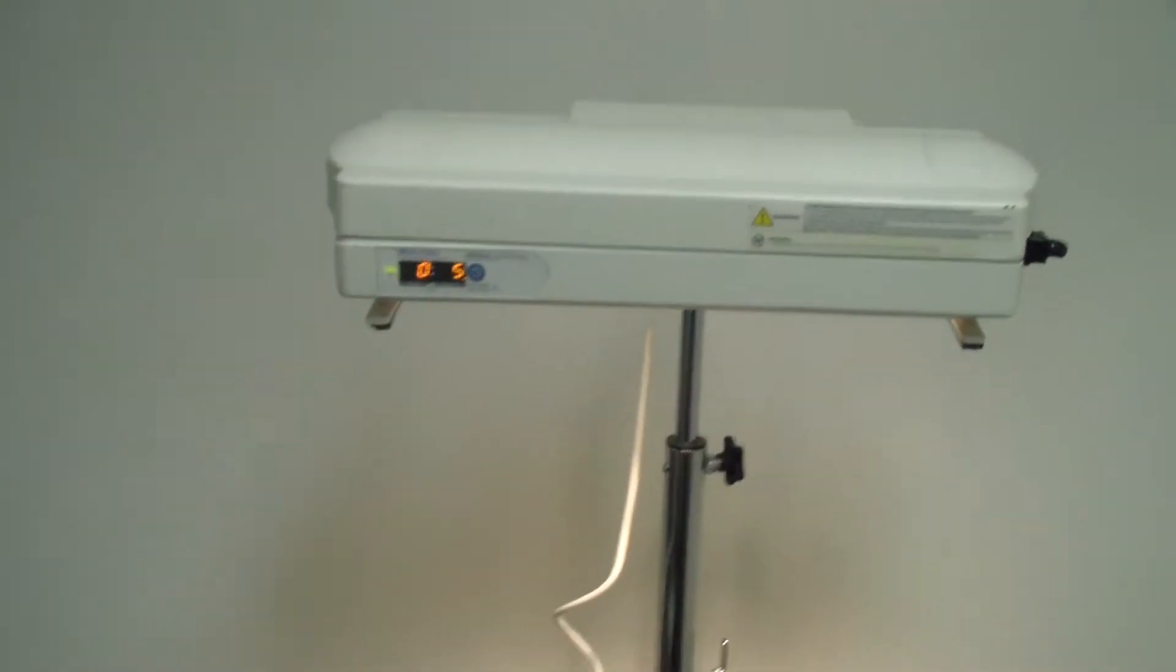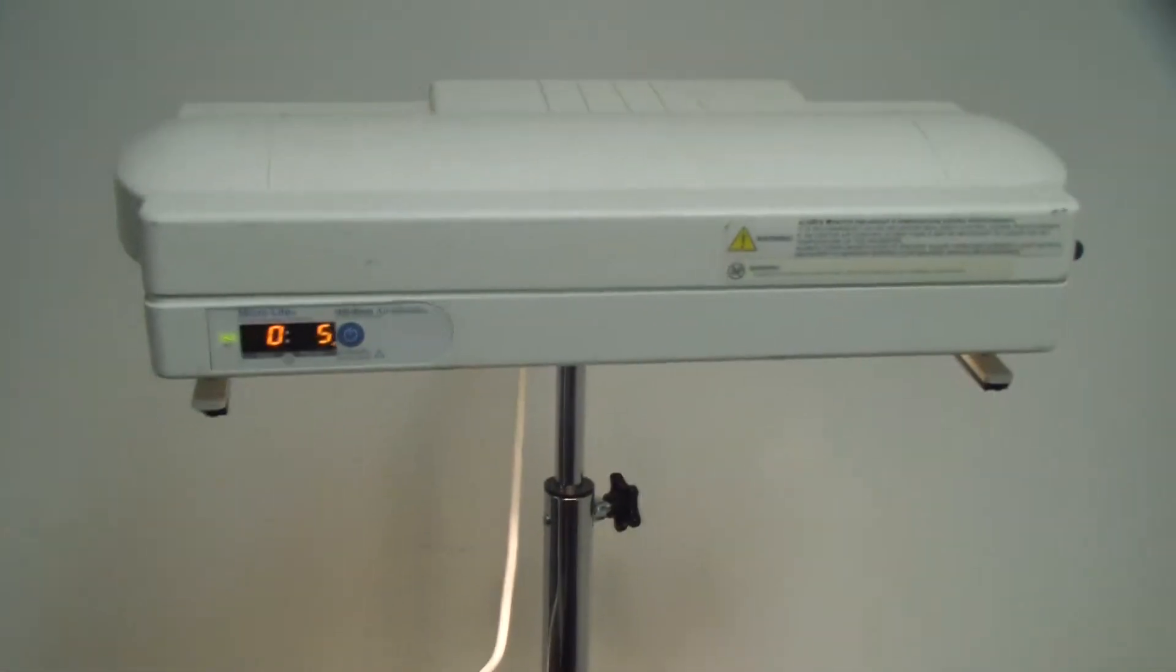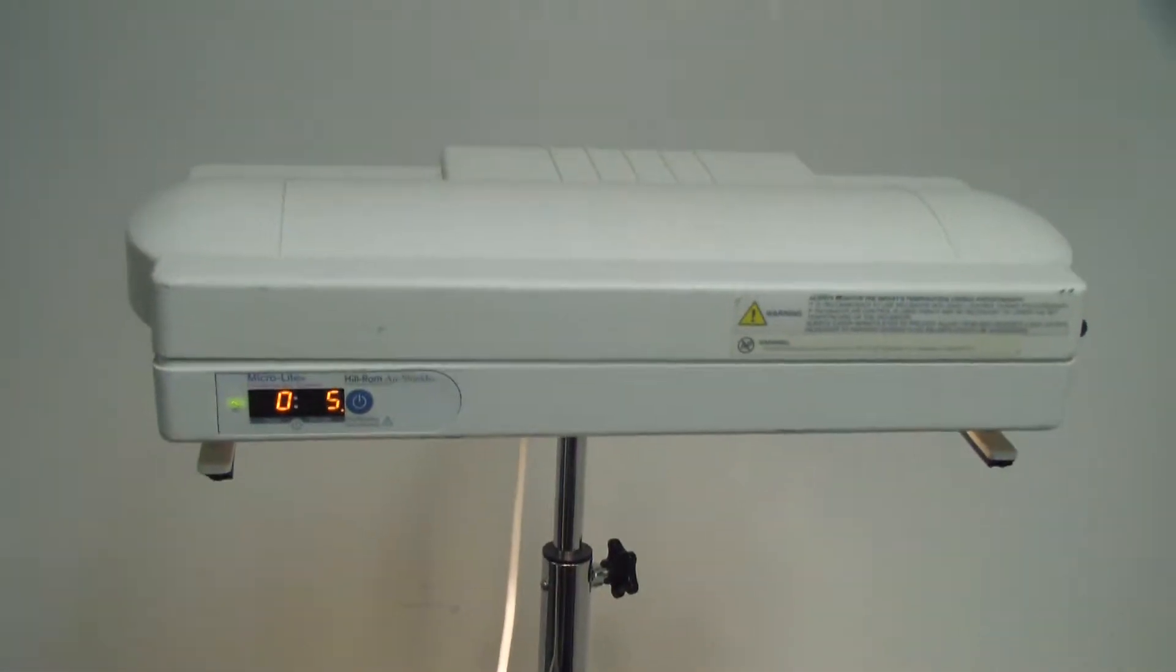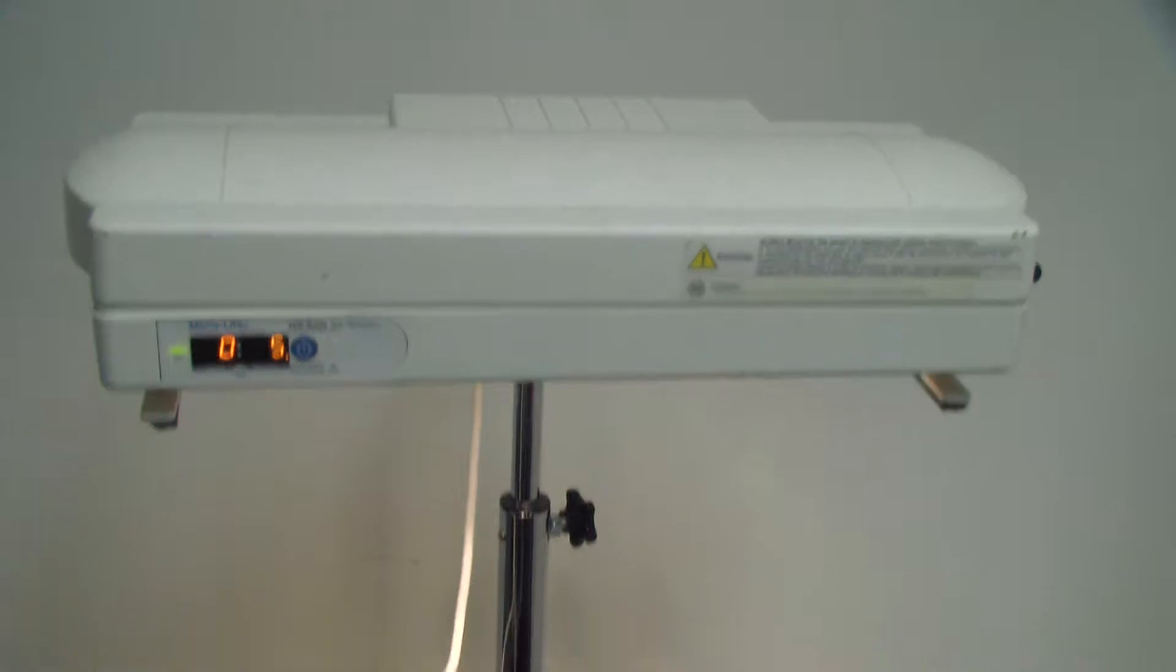It's DCSP Medical. We're looking at a Drager Microlite Phototherapy System. It's in pretty good condition. Power's on.